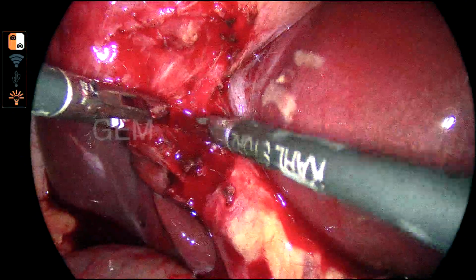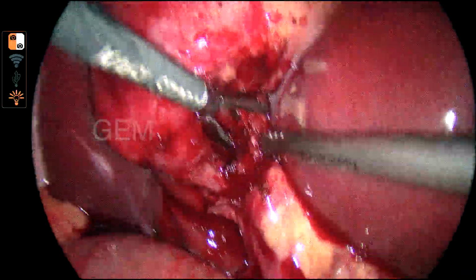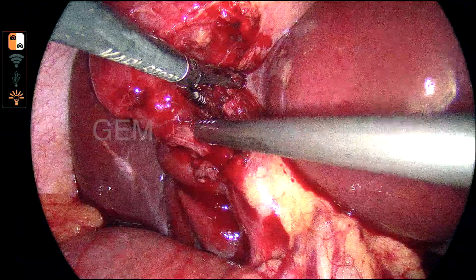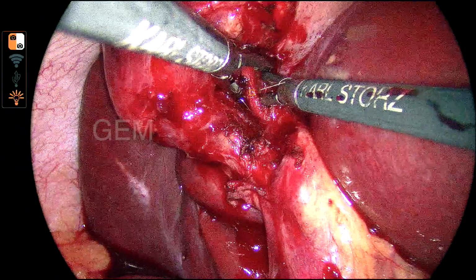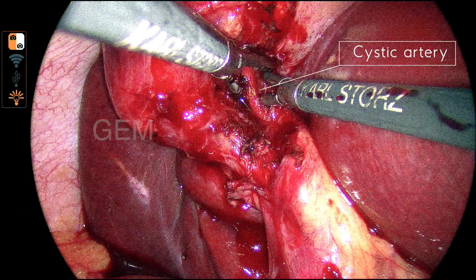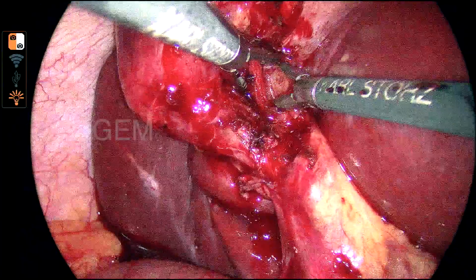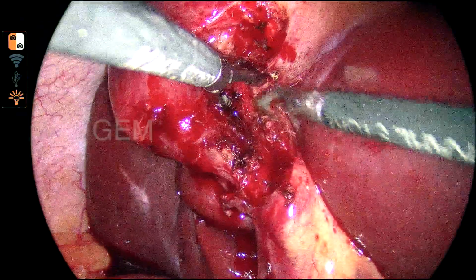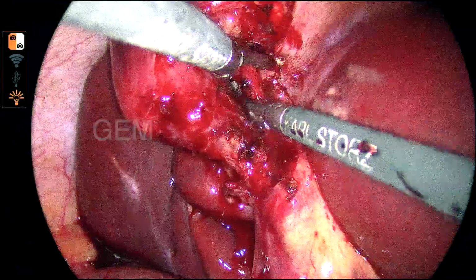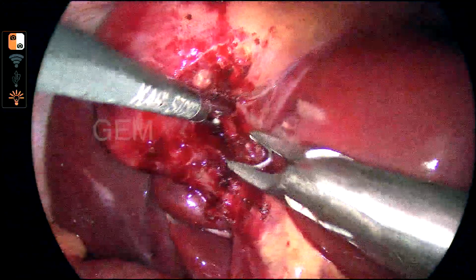So now I am coming again on the anterior side, and I am trying to dissect the cystic artery and cystic duct. So that is the cystic artery. Tissue edema is there. You can see when I apply coagulation, there are a lot of fumes, and more coagulation is happening because of the wall edema.